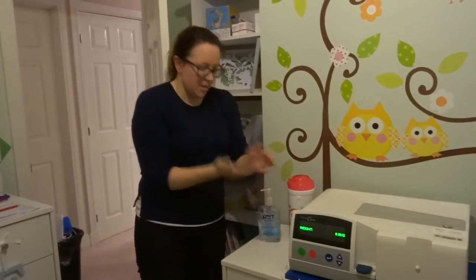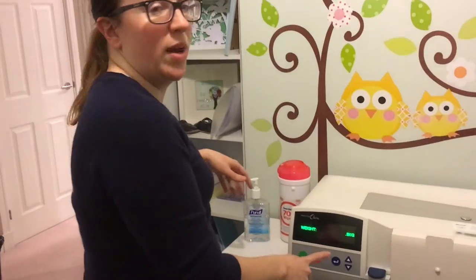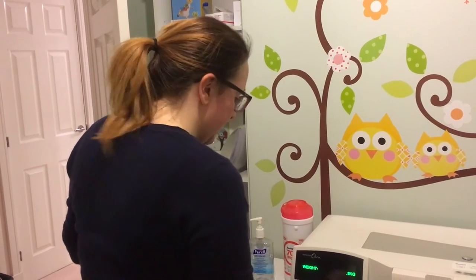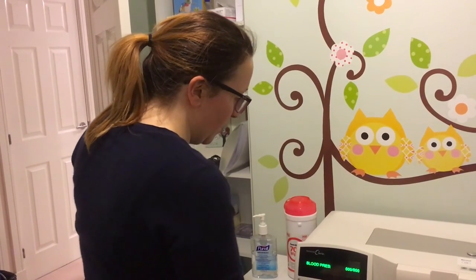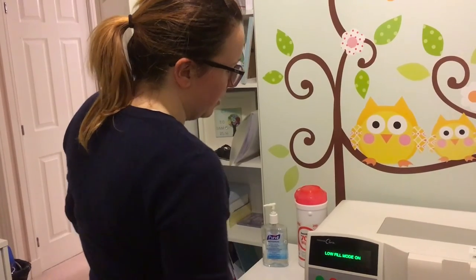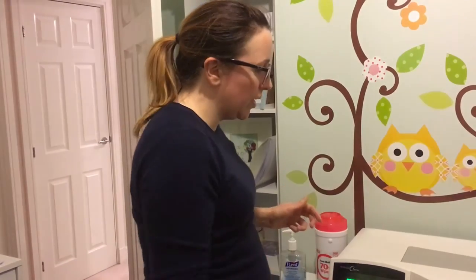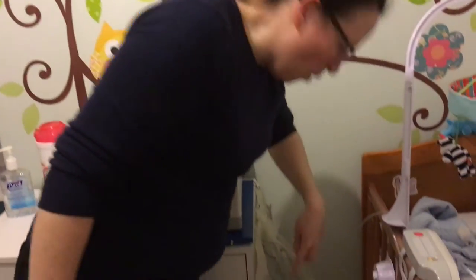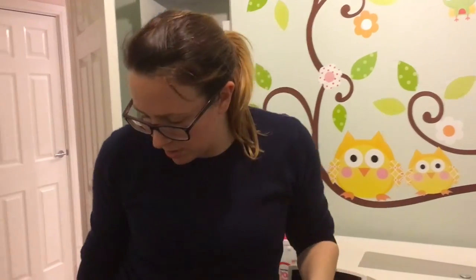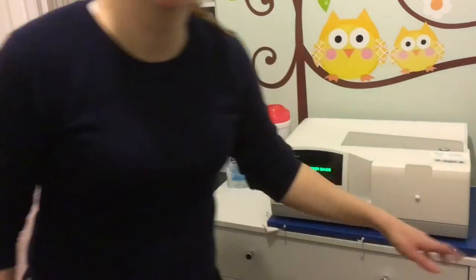More alcohol gel. I put his weight in — the machine remembers yesterday's, so we round it to one decimal place. We also enter the blood pressure: it was 86 yesterday and 78 today. Then I press the red button and it goes to low fill, then press go to start. Our bags are draining on the side and aren't quite done yet — one will go onto the heated plate shortly. I press go and it'll ask if the two chambers are mixed, which I'm aware of.